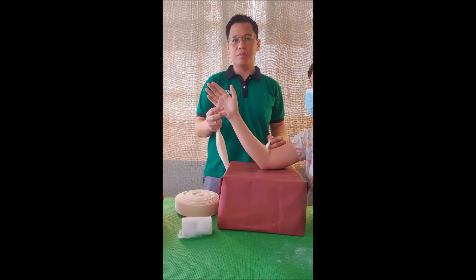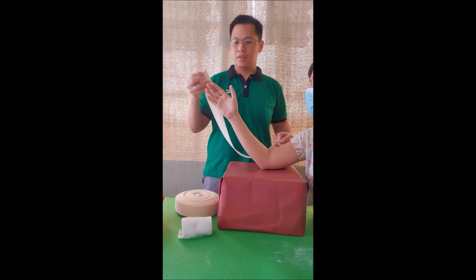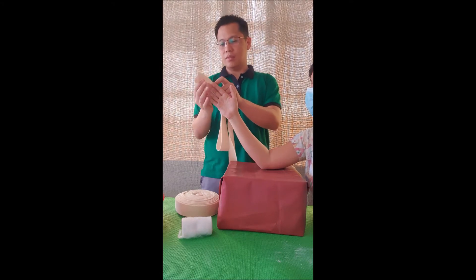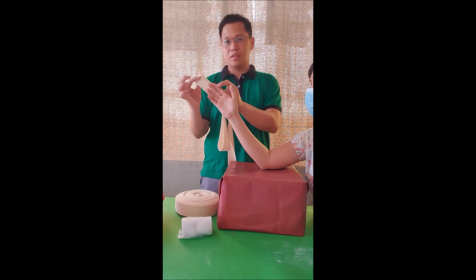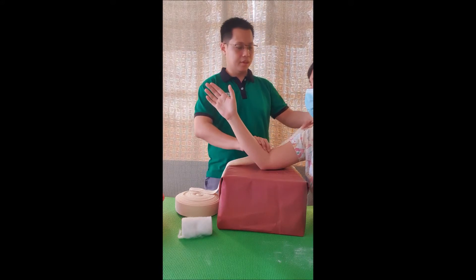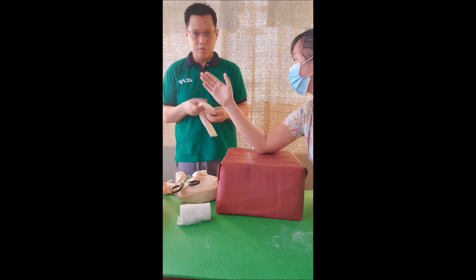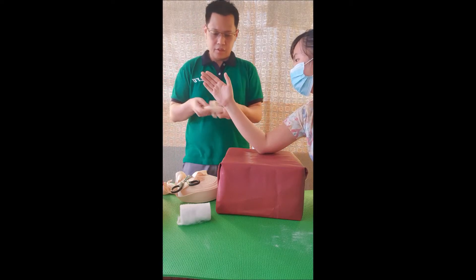We will start this procedure by measuring the adequate length of the stockinette needed. The stockinette should reach around two to three inches distal to the fingers and up to the level of the shoulder area. After cutting, we will roll it inward for the convenience of the patient.